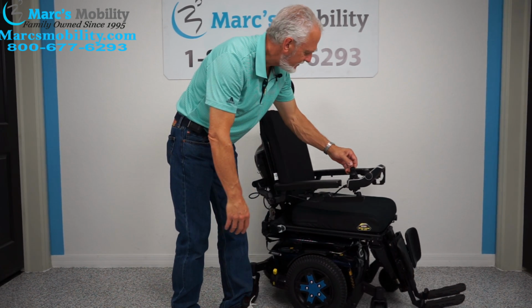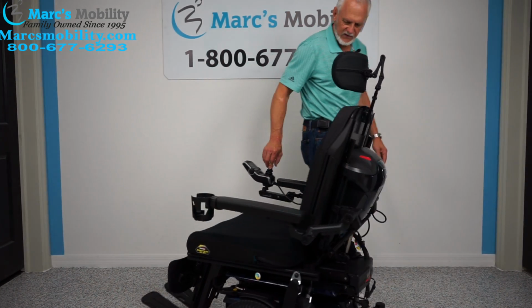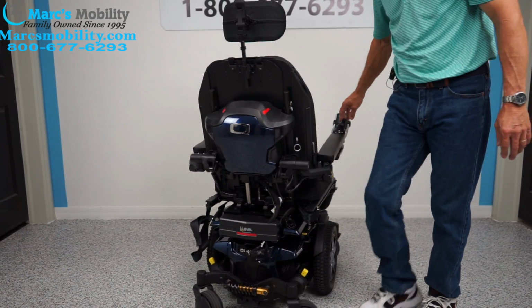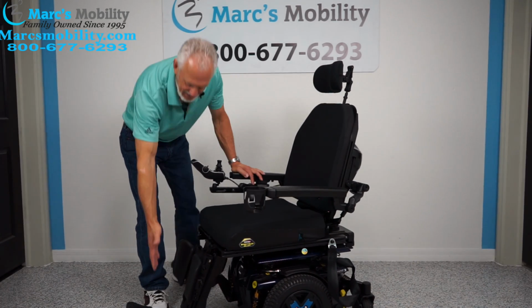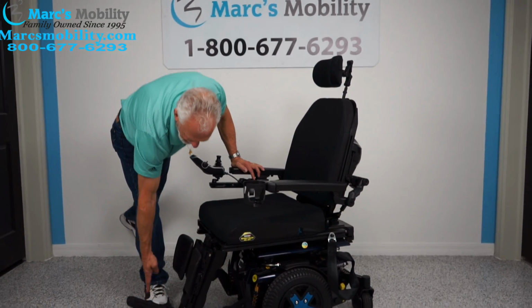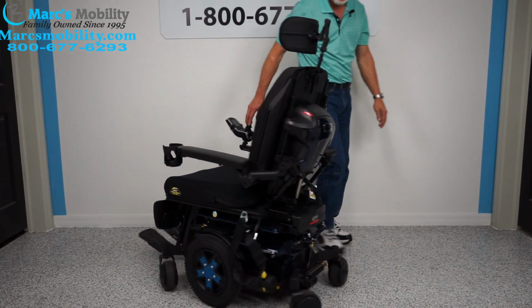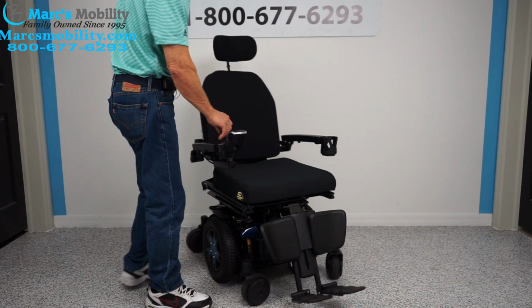So it's mid-wheel. What that means is when you turn a circle in your home, let me bring it over here, you can do this all day long in your house. Let me go a little faster here. You can do this all day long in the same spot. Now if you bring these legs all the way in, now they're out, but if you bring them all the way in your house, it's going to be even better. So that's what a mid-wheel drive chair does.